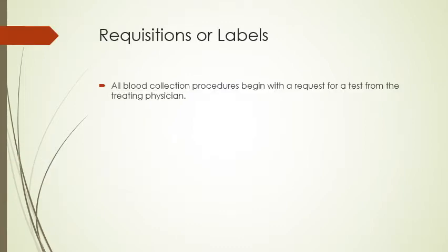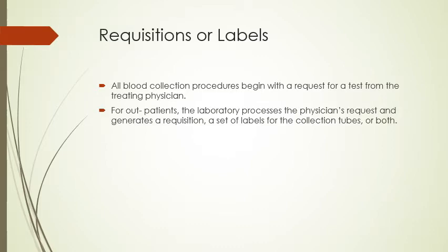Anytime we go to collect blood, the procedure is always going to begin with a request for a test from the physician, or their physician assistant, nurse practitioner, whoever it may be that can order the blood draw. That is what is going to start this whole process of the collection procedure.